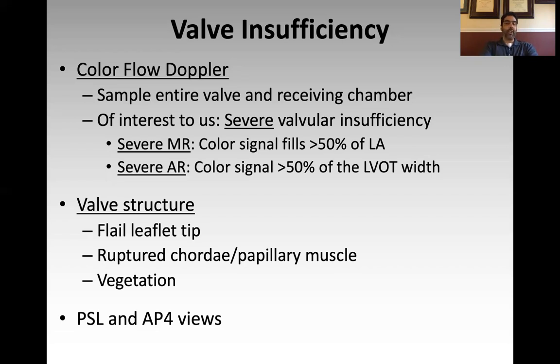What we do is a very quick and dirty assessment. And so it is, I will admit, a very incomplete assessment for severe valve insufficiency. Okay, so what you would do in general is put color over the valves. If you see something that looks concerning for severe valve insufficiency based on what I'm telling you, order a formal echo. Okay, but while the formal echo is pending, you can start your interventions based on the assumption that you have a shock state with a severely insufficient valve.